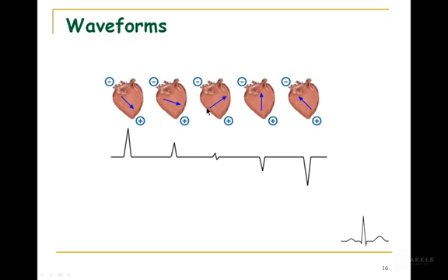This one's pretty much perpendicular, so this one is a biphasic or equiphasic one, or we could have had a baseline recording. These two are negative, downwards deflected waveforms because the vector is running towards the negative recording electrode, and the one that gives you the most recorded voltage would be the one again that's running parallel to the particular lead axis.